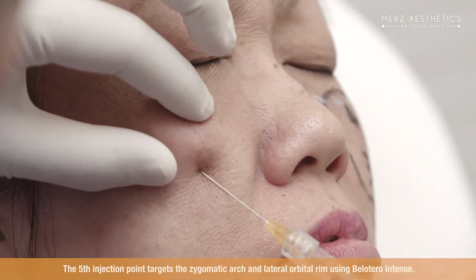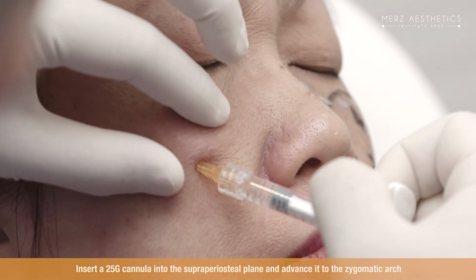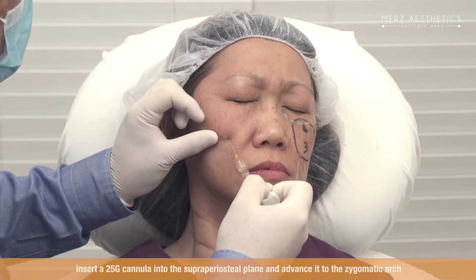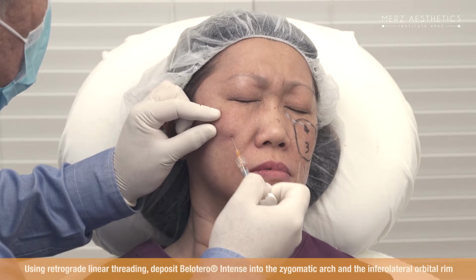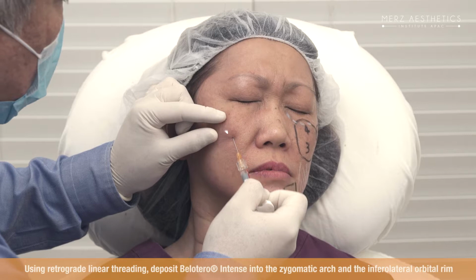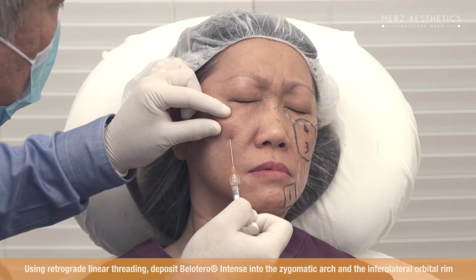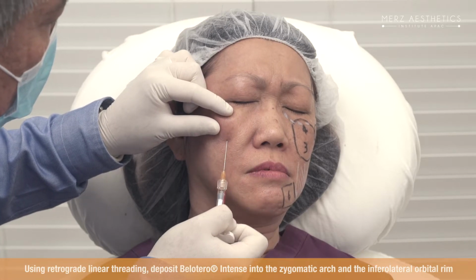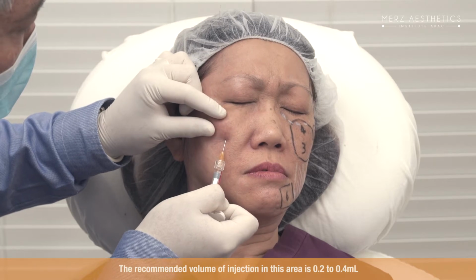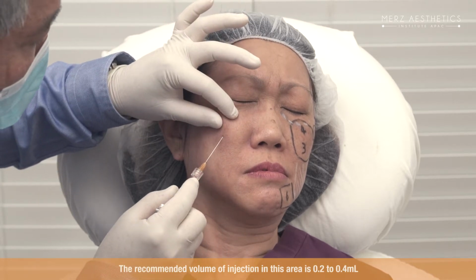For the fifth injection point, reinsert a 25-gauge cannula through the insertion point in the mid-cheek into the supraperiosteal plane, advancing to the zygomatic arch and lateral orbital rim. This is the only injection point that is not targeting a distinct fat compartment. The filler is deposited above the bone. Deposit Belotero Intense using linear threading with the cannula running tangentially to the zygomatic arch and the inferolateral orbital rim. These areas undergo resorption with age, and placing fillers here restores support to the face. The recommended volume of injection in this area is 0.2 to 0.4 milliliter.